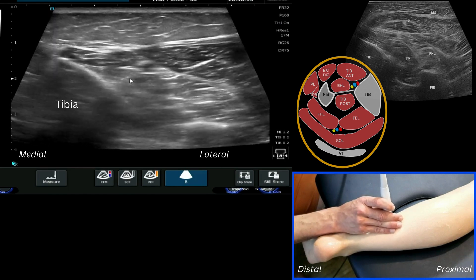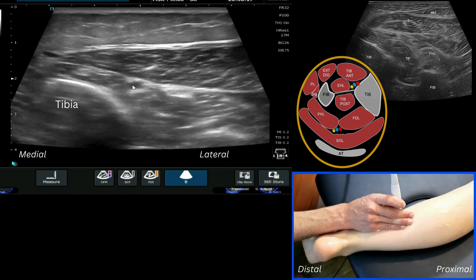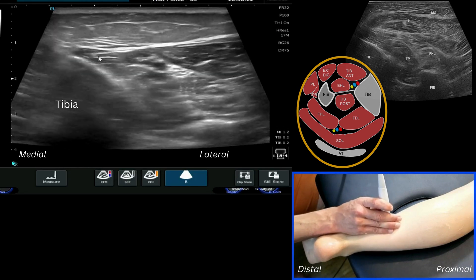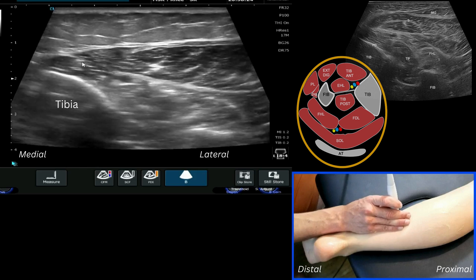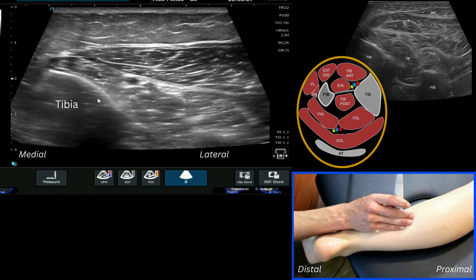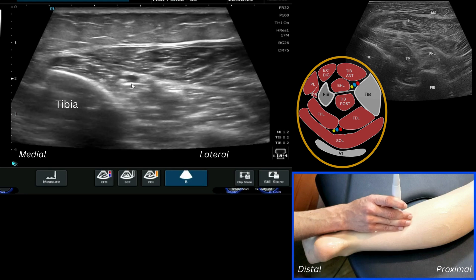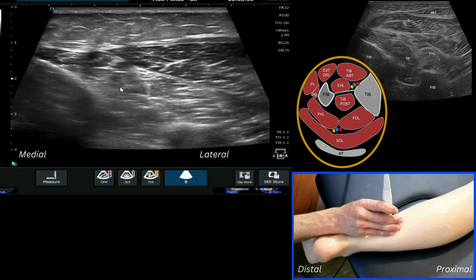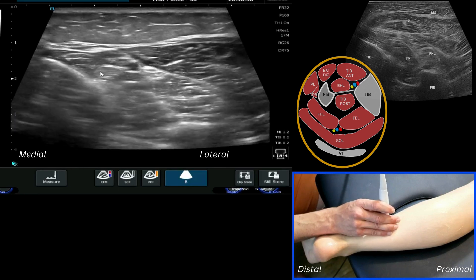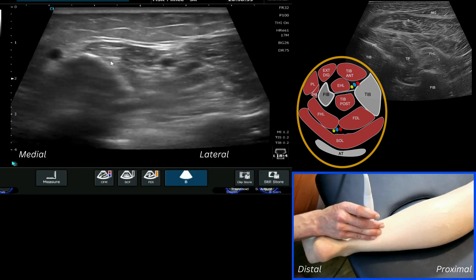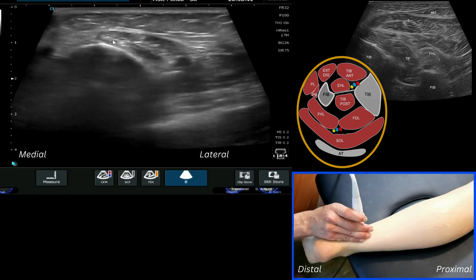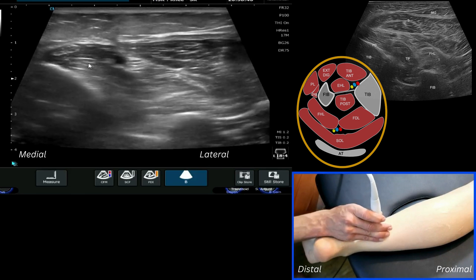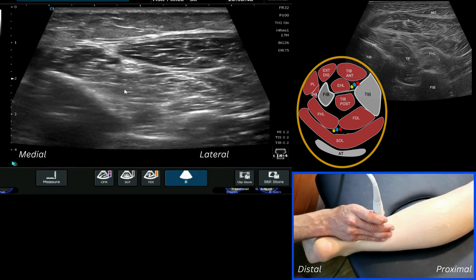We increase our depth and width of the image at this point. Now we start to see the formation of muscle — we know that this is flexor digitorum sitting most anteriorly and medially here, this is the tibia, and we can see our posterior tibial artery which is a nice landmark. Underneath this we've got tibialis posterior, and this is the tibialis posterior tendon which we can follow back down into the tarsal tunnel region accurately.